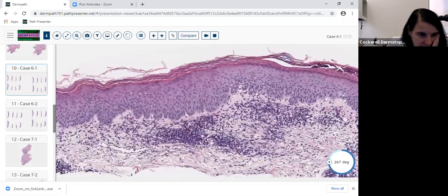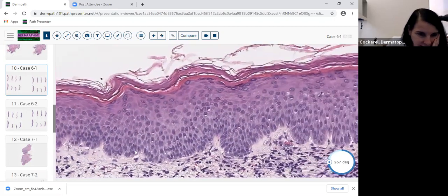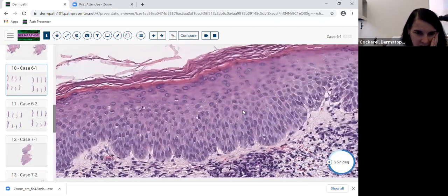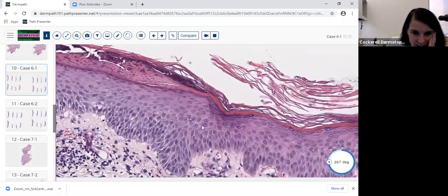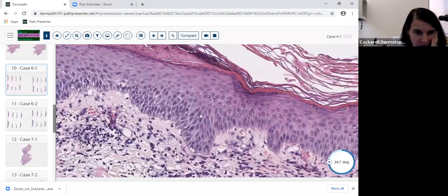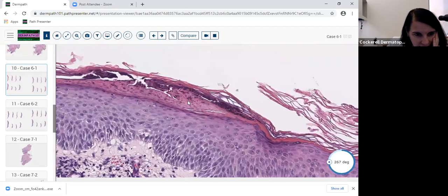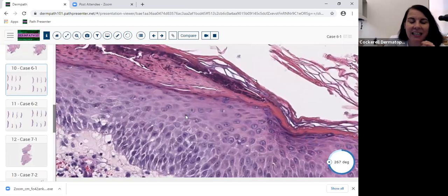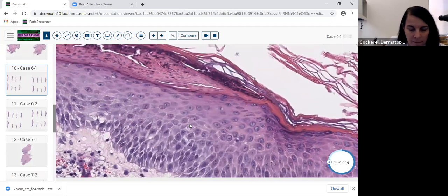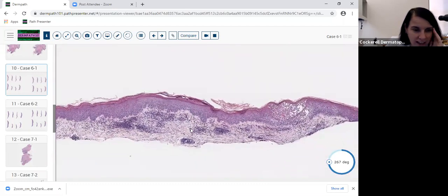So I did get a PAS stain on this case. I'm looking around and I'm not easily finding these hyphae. So we're not just doing the PAS to pad our wallet or to pay for our immunostainer. We're doing it because the hyphae are very hard to find, especially with some inflammation in here. And maybe there's one right there. There you go. There's a couple right here. But some of you who say, well, are those really septate? On the test, they're going to show you tinea that's teeming up there. So remember, when you're looking at an inflammatory process and you're like, what the heck is this?